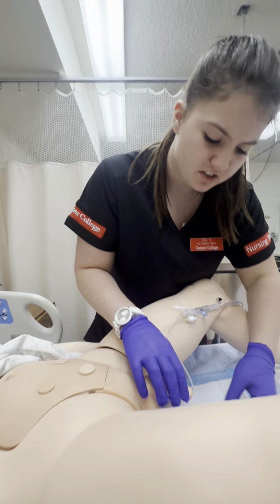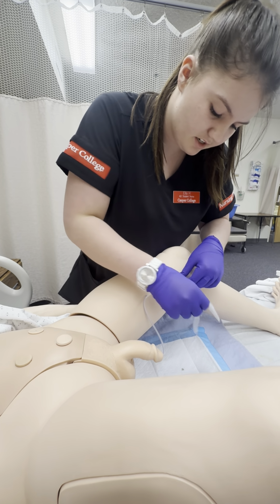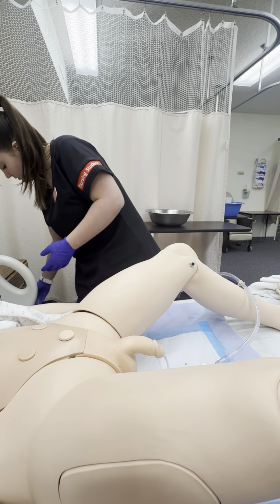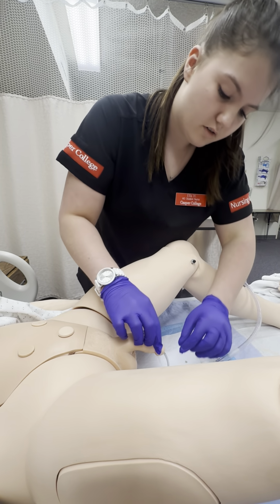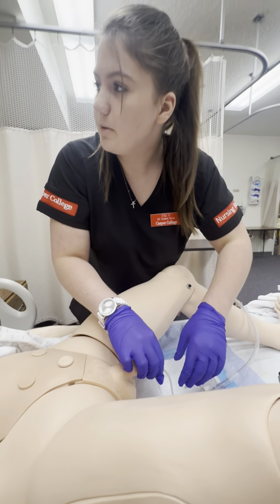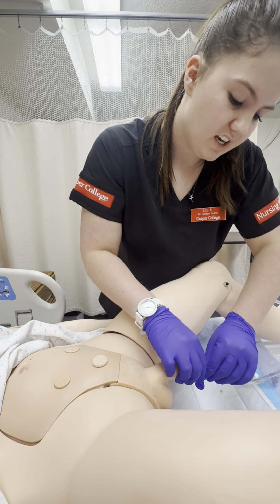Okay, are you still not feeling any discomfort? No, everything is fine. Okay, I'm gonna go ahead and remove this adhesive to your leg. Make sure that that's not tugging on anything. All right, I'm gonna go ahead and grip the meatus. I'm gonna have you take a big deep breath in. Is that all right, Jerry? As I begin, I'm going to tell you when I'm about to take it out, and I'm going to have you exhale, okay? All right, big deep breath in, and take it out.